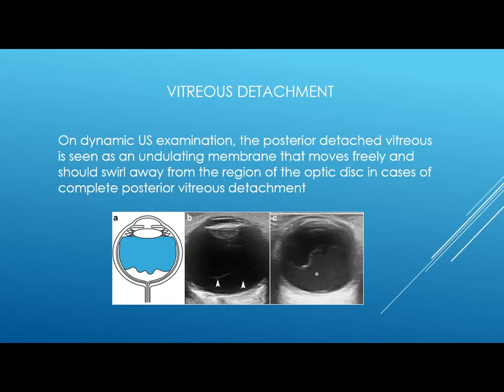How it appears, like in this diagram: it appears as an undulating membrane, and in dynamic examination it moves with the moving eyes. It is anterior to the optic disc and not in contact with the optic disc, to be differentiated from retinal detachment.